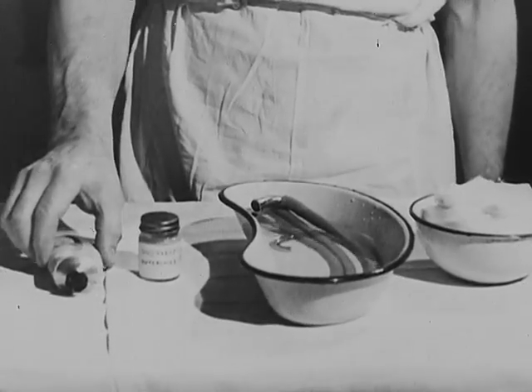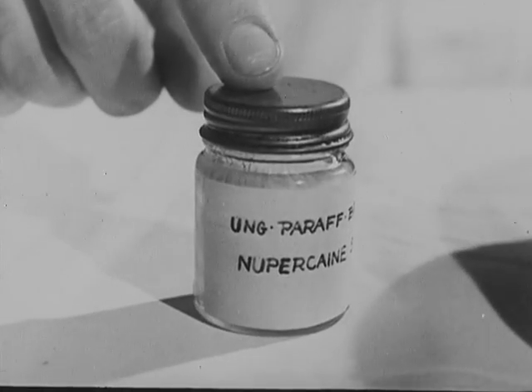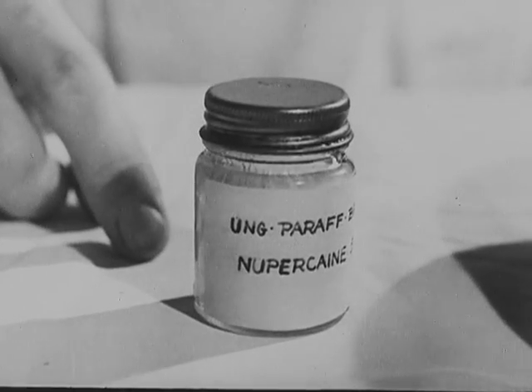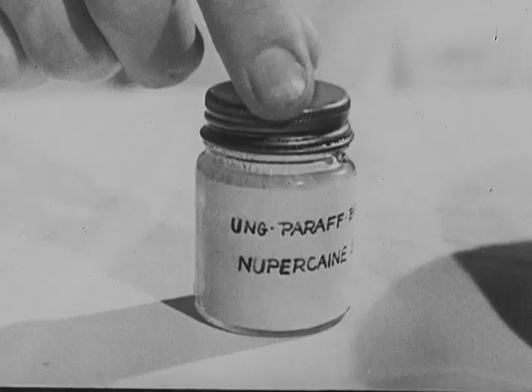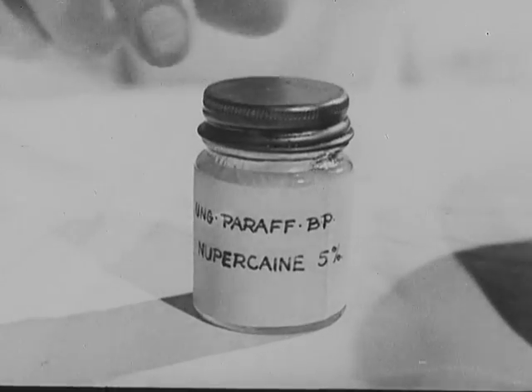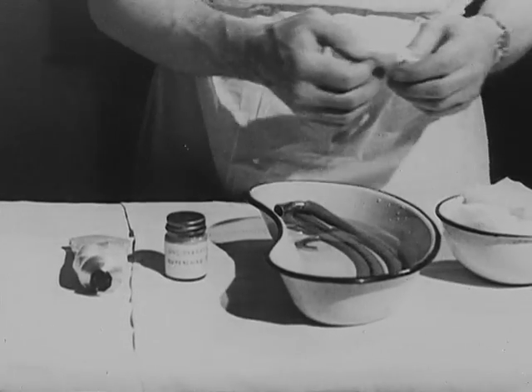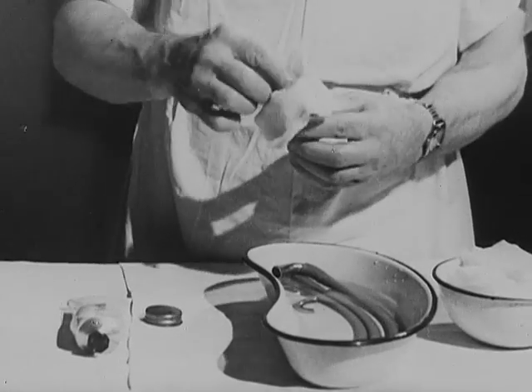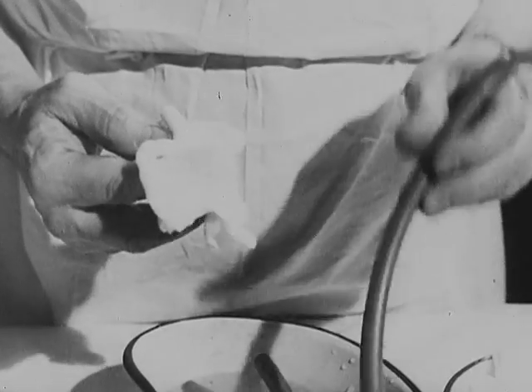Vaseline is a satisfactory lubricant, but even better is a lubricating medium which contains a surface anesthetic such as Nupercaine, because this reduces the tendency to cough when the tube is moved during light anesthesia. This is a useful formula. Lubrication serves 2 purposes. It makes intubation easier and also helps to protect the mucous membranes, which may be dry as a result of pre-medication.